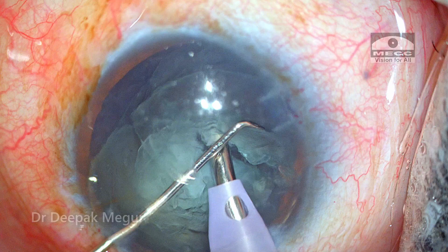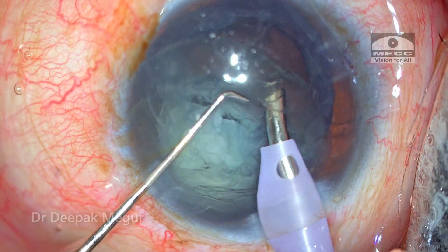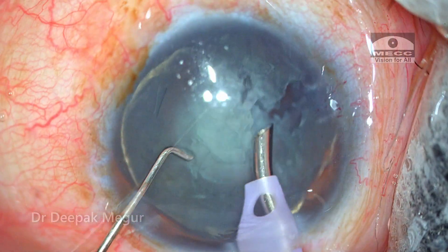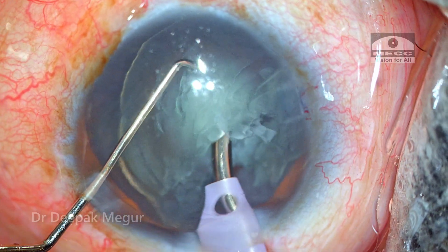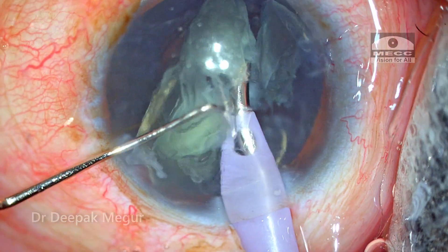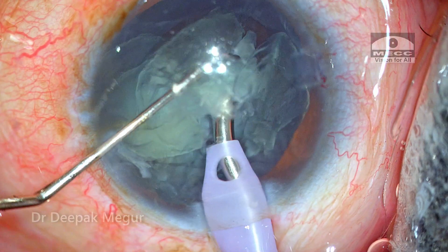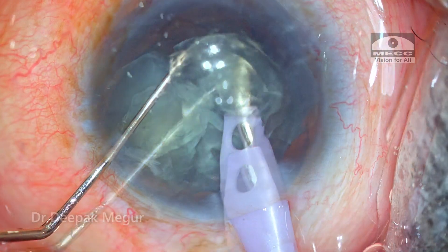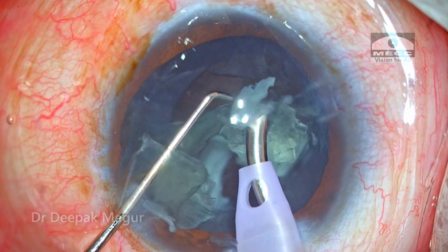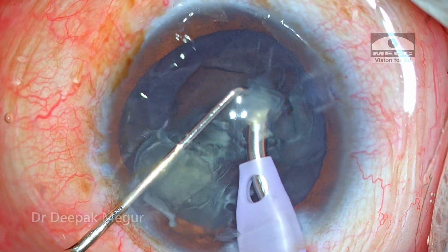Since the nucleus is very soft, I'm not very worried about endothelial trauma, as the nucleus management is going to be predominantly in the anterior chamber. Dividing the nucleus is not going to be much of an issue because it's a very soft nucleus, and very carefully with minimal ultrasound energy the nucleus is emulsified bit by bit, ensuring that there's no turbulence in the anterior chamber.